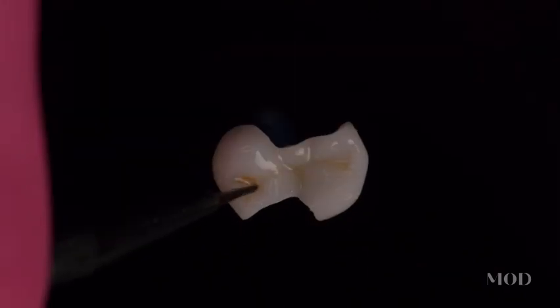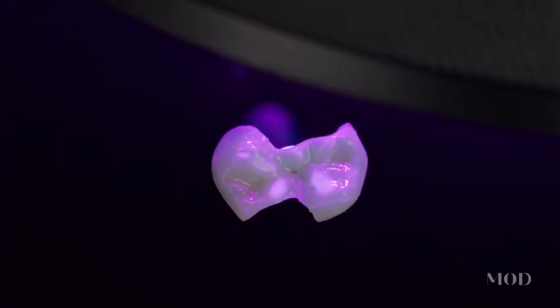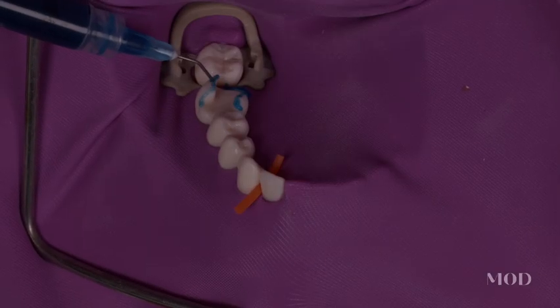Nothing has been more powerful in my practice career than partial coverage restorations, and I'm super excited to bring you everything that I've learned with a 3D printing twist on it, so that you can start implementing these types of restorations for your patients — which are going to be something revolutionary for how you think about what a tooth is, and more importantly, how you can preserve that tooth for your patient.